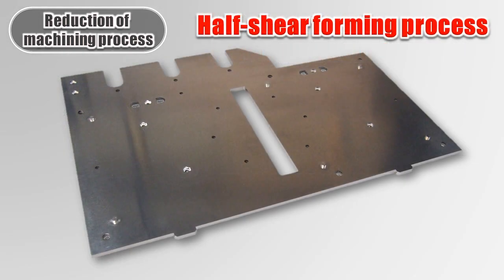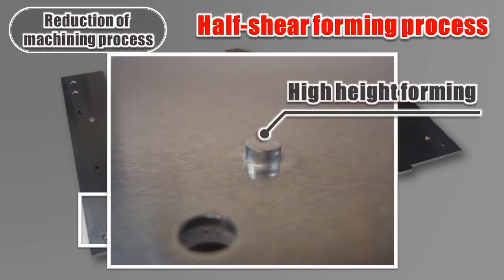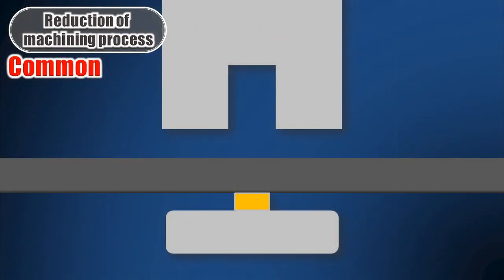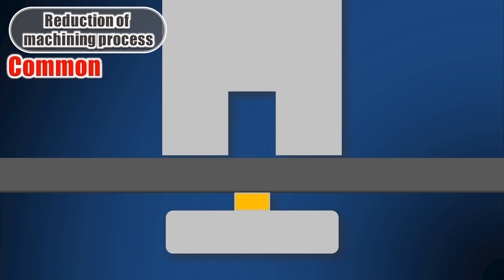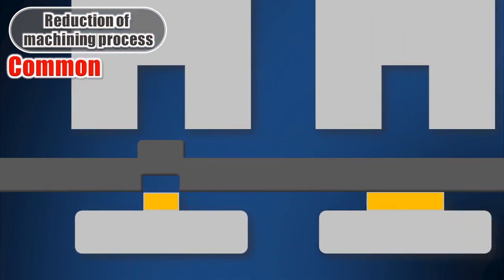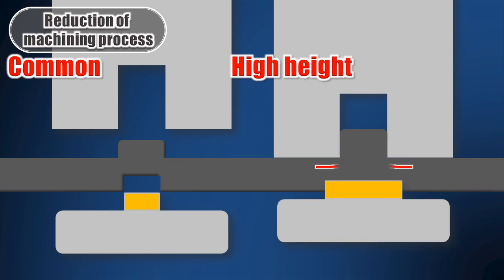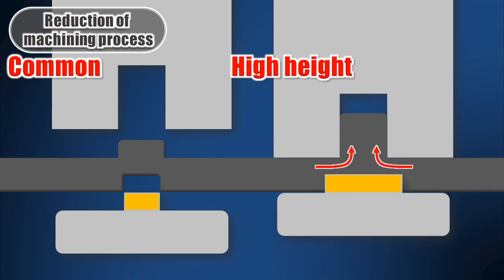Also, high upward half-shear forming is used so that the 2 thick sheets can bond well. Generally, for upward half-shear forming, the top tool diameter is larger than the bottom one, but it is breakable and cannot form high. So by making the bottom tool diameter larger than the top one, it is less breakable and permits high forming.